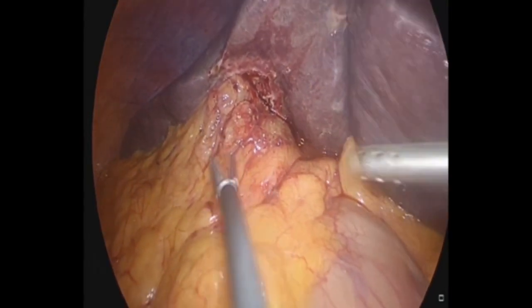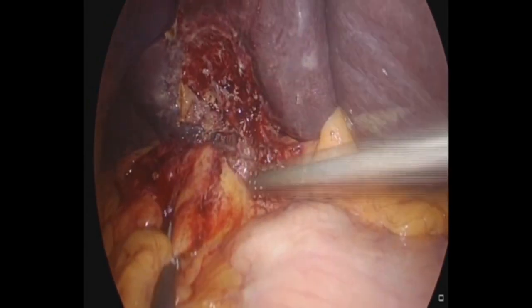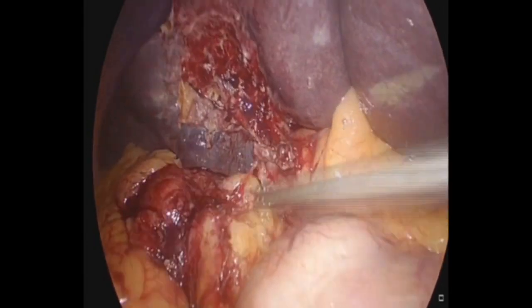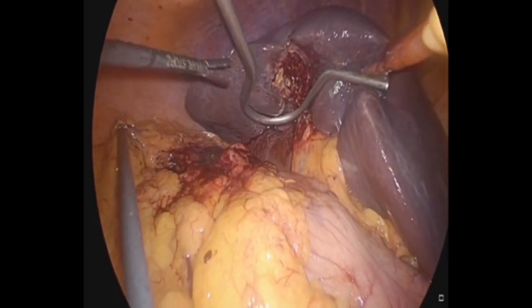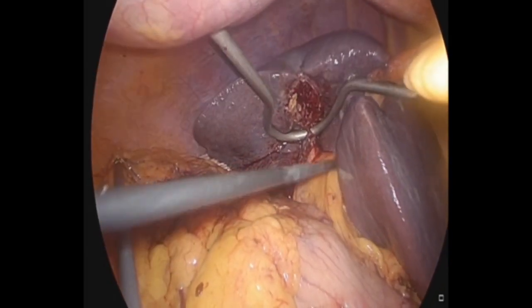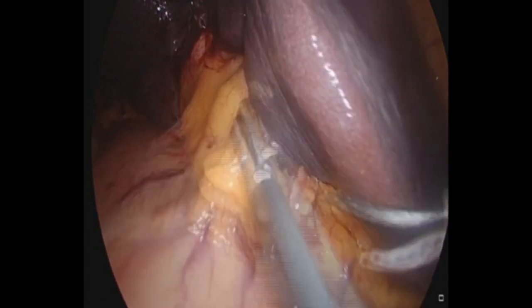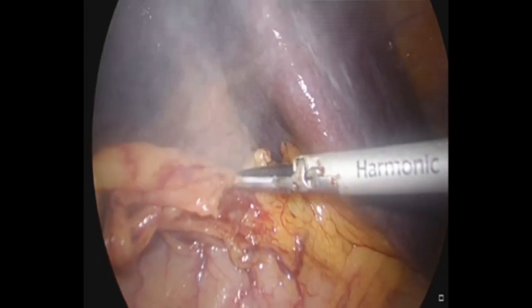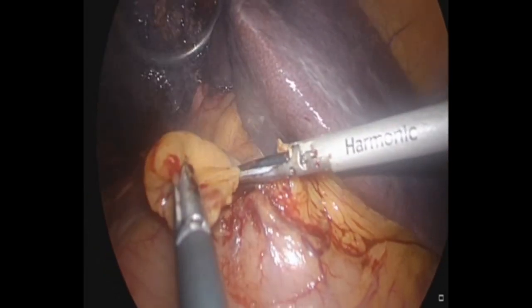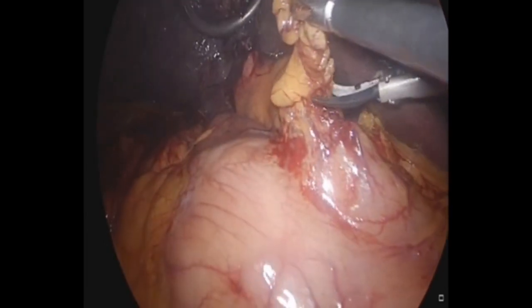For port placement, the optiview is placed supraumblically and two ports are placed on the right of the midline and two on the left of the midline. The right subcostal port is used for the Nathanson liver retractor. The left subcostal port is used for applying clips during liver dissection. The operation can be divided into two major steps.